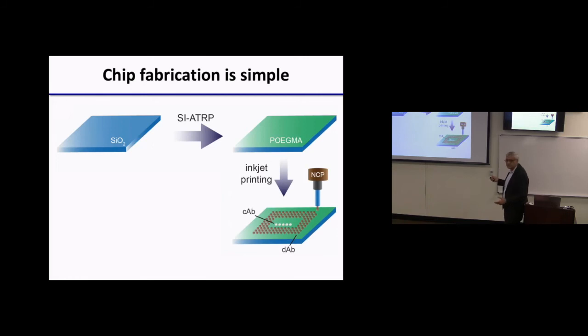You print spots. These are not labeled with the fluorophore, so in the central region you would not be able to see anything. You can actually barely see the scattering from the salts in the buffer when you print.